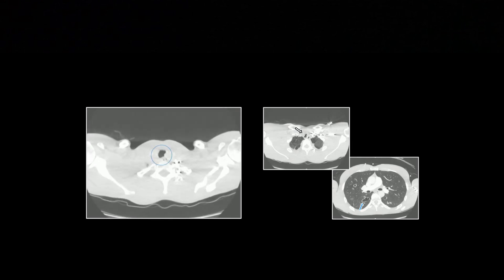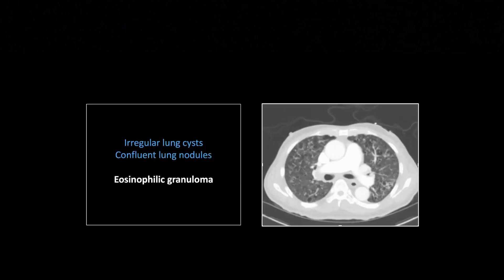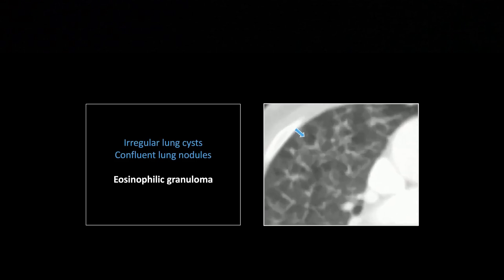So that is laryngeal papillomatosis. Another cystic lung disease, this one associated with small nodules as well. That's the way I always think of this: small irregular cysts with no wall and tiny nodules simultaneously. That is eosinophilic granuloma.